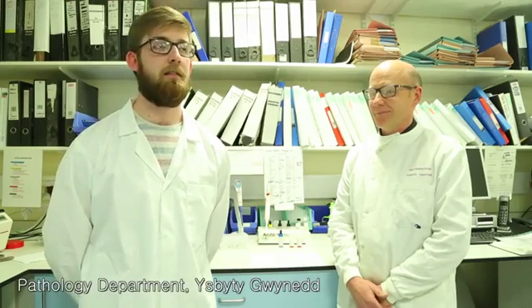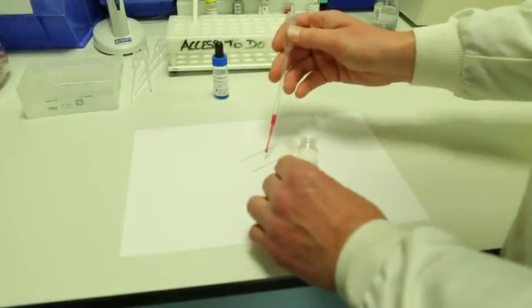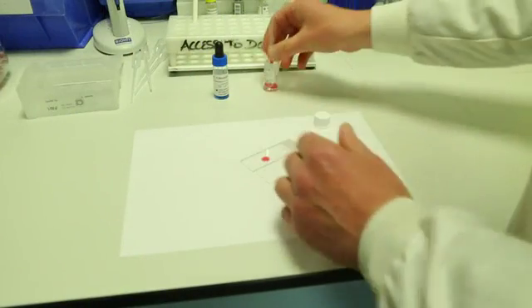Hello, we are in the pathology department of Gwynedd Hospital. I am joined by Mr. Trevor Roberts, and we are going to be showing you the slide agglutination test for determining blood groups. We're now going to demonstrate the hemagglutination technique.